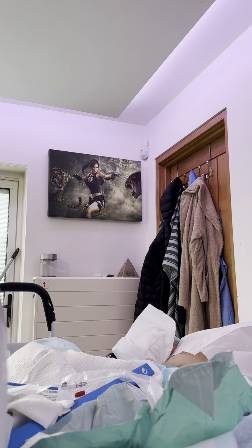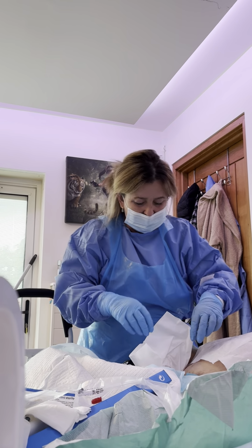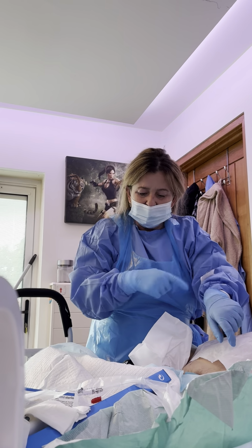Unfortunately, I did not know that these would have that smell again. All the stickers, the smell's gone. I will be phoning the hospital up and telling them it's another faulty batch, because it shouldn't be brown. Nothing should be brown like that. These are not sterilised. I don't need sterilised gloves for this part.